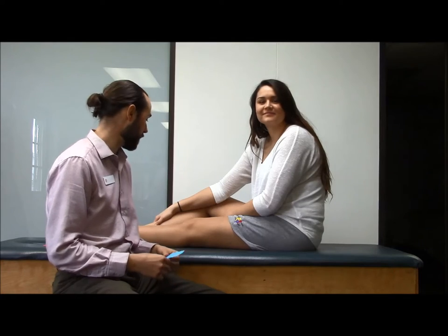Hey everybody, Luke and Ashley here. We're going to look at a few different things for K-Taping the knee for knee instability. I'm going to show you three different types of K-Tape we can do.